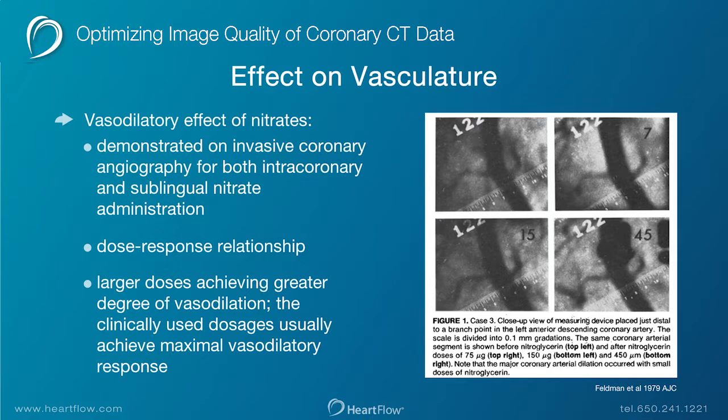These data that I showed you, or this anecdote I showed you, is well established both in the mechanism of nitrate administration or nitrate-mediated vasodilation, but also going back historically into the angiographic literature. Here are examples from the historical literature dating back to 1979 from Dr. Feldman's paper in the American Journal of Cardiology. We can see the vasodilatory effects in a similar fashion, in this case on invasive angiography. What we see here is both intracoronary and sublingual nitrate administration results in significant enlargement in the coronary arteries.